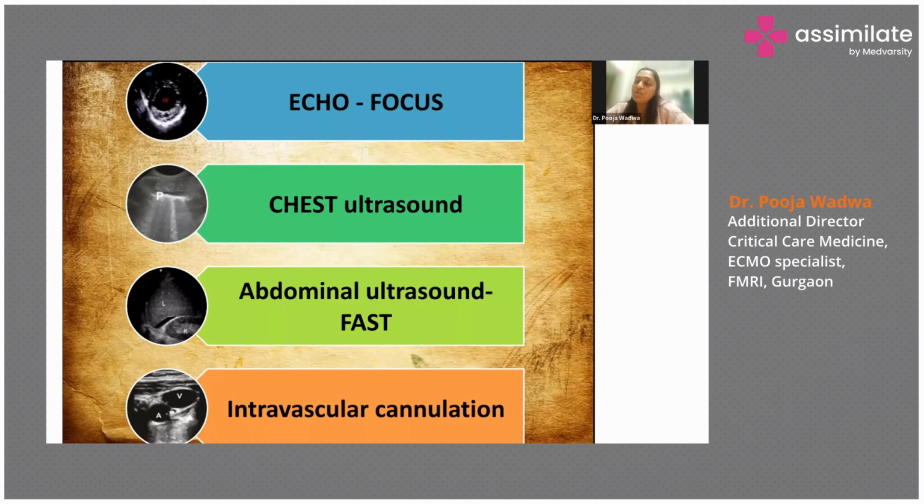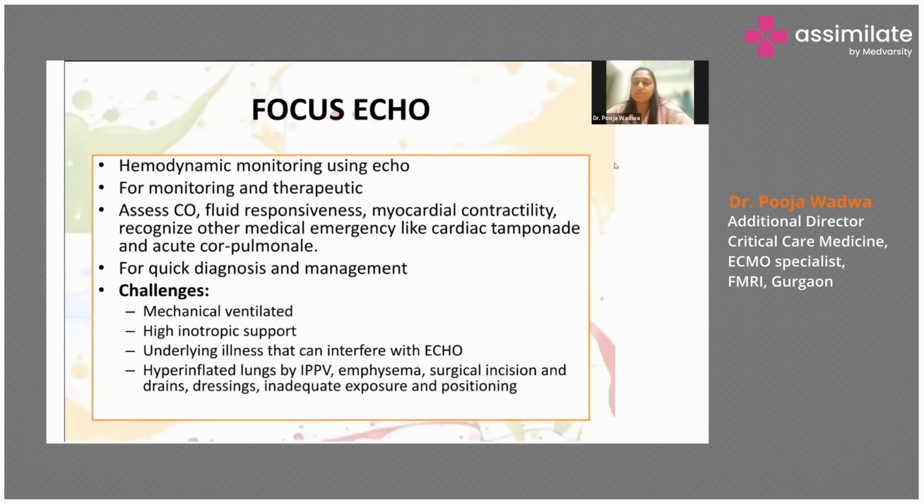And last but not the least is intravascular cannulation, which is very important. It is coming up very fast now because no patient likes to be pricked multiple times if you do it without ultrasound. Plus, the number of complications with the use of ultrasound is markedly less than if you do it blindly. So let's see how we can use ultrasound as a modality in our ICUs.